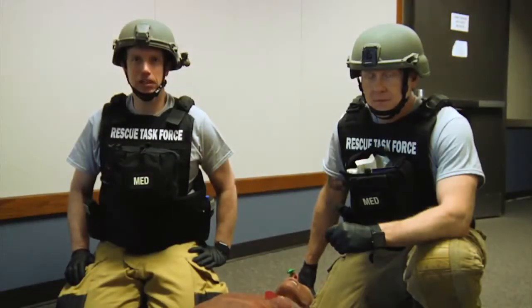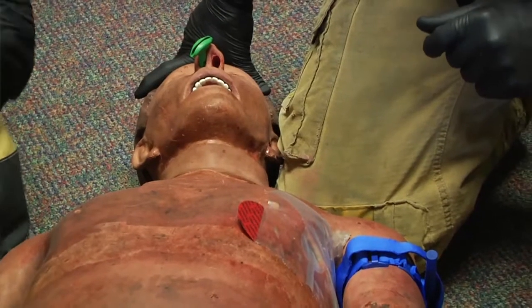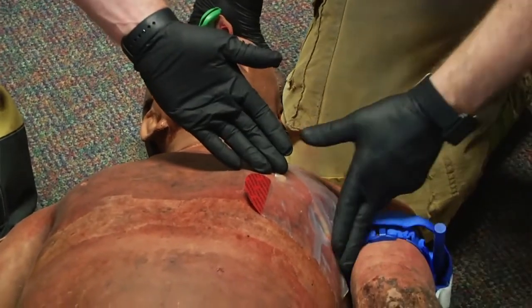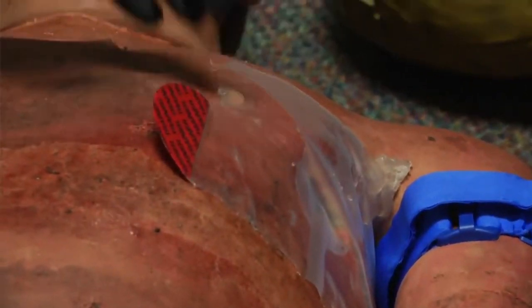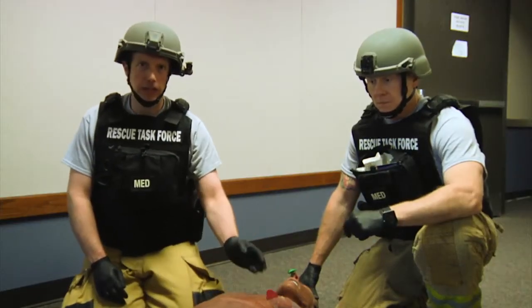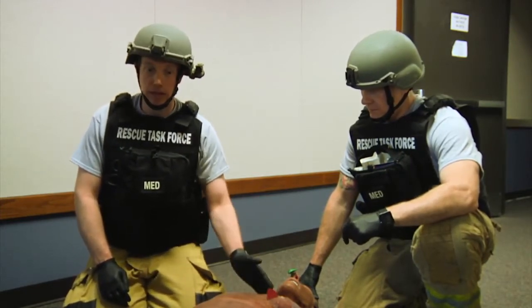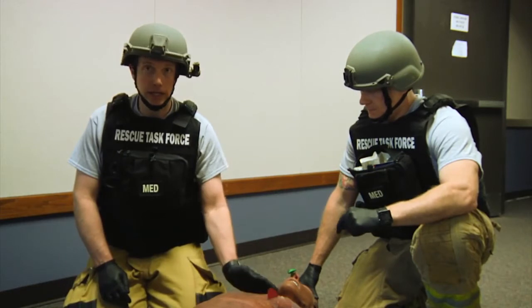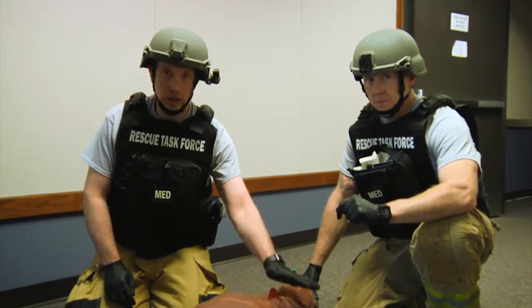So today we have discussed airway management within the Rescue Task Force concept. What we have done is we've applied a chest seal to return the integrity to the chest wall where we had a penetrating injury. Remember, we're going to apply that chest seal anywhere that we have an opening to the body that wasn't there when they woke up, from their neck to their navel.